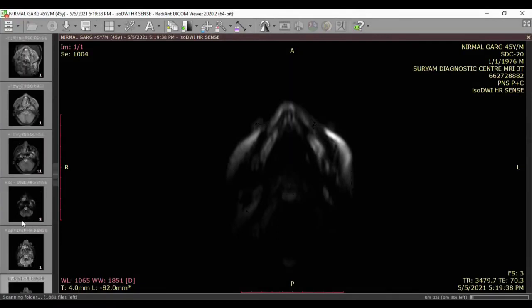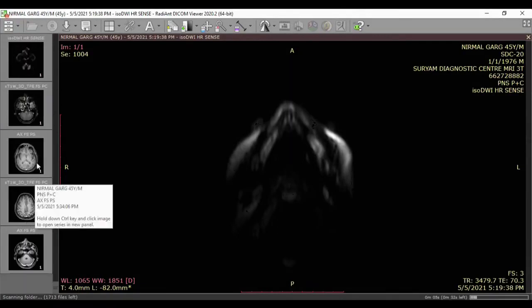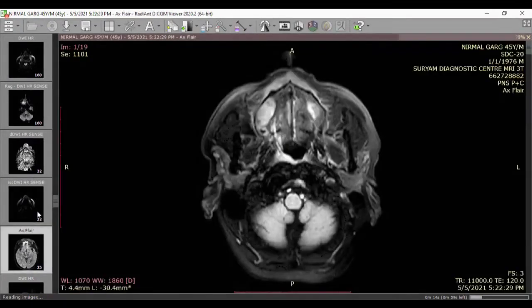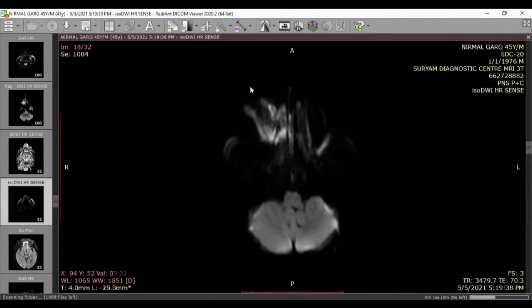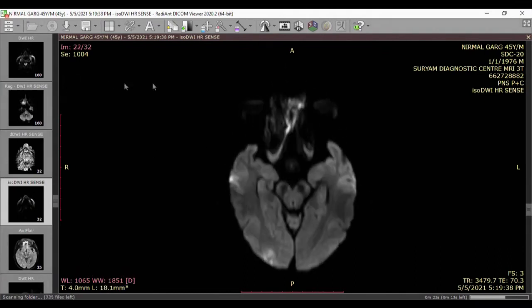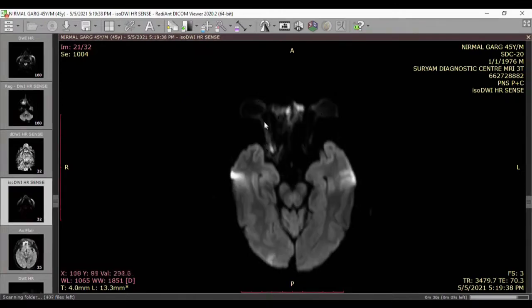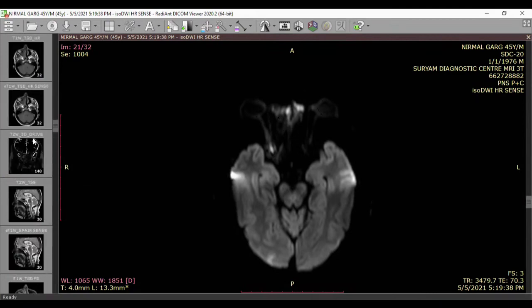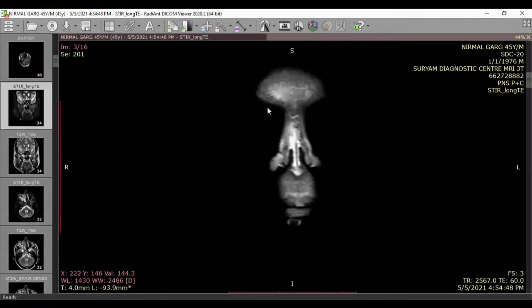And another thing, sometimes patients present with little diminished vision or early vision loss. And how can you pick that up? By means of a good diffusion weighted imaging. See this patient. He presented with vision loss, presented to us in the evening, same day, and had an optic nerve infarct. Hardly any disease, very limited disease, yet presented with preferential orbital involvement.